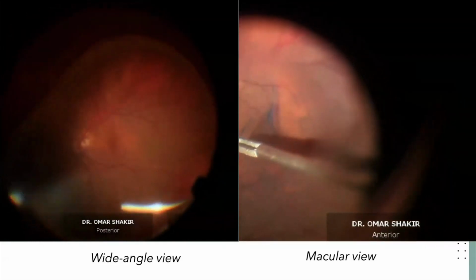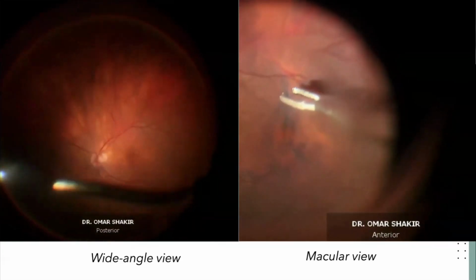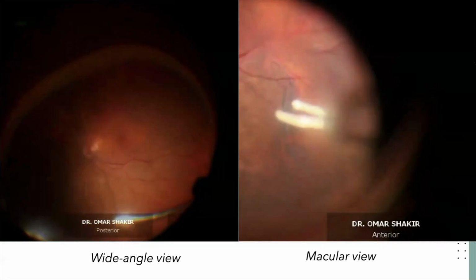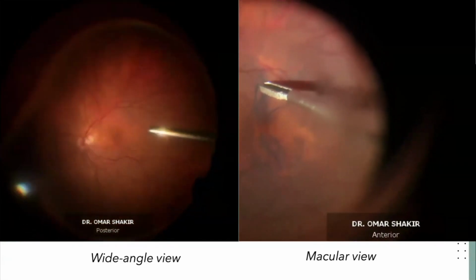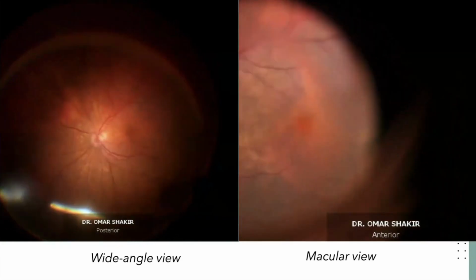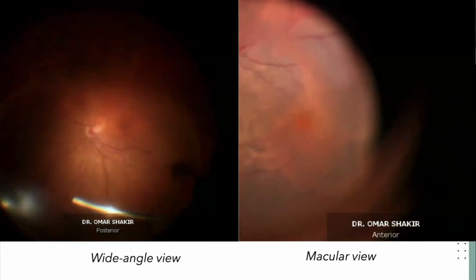But then that doesn't work so well for wide angle needs, such as clearing vitreous from the vitreous base, which is what you're watching happen on the left, taking care of retinal detachments.